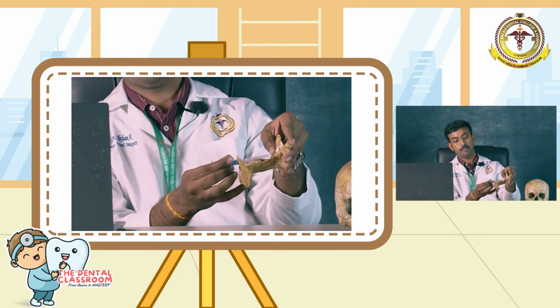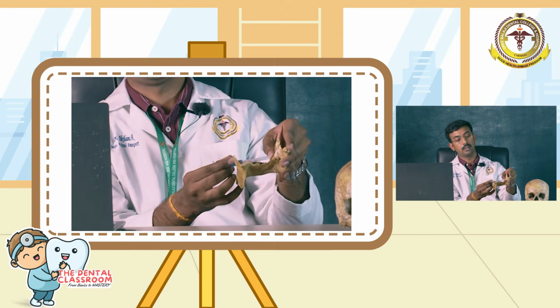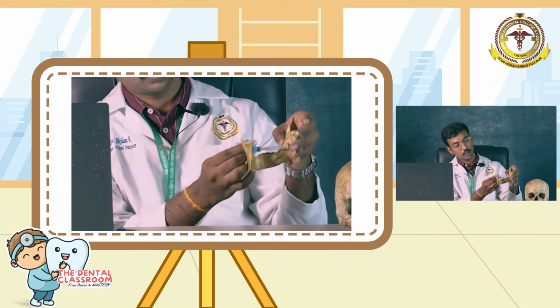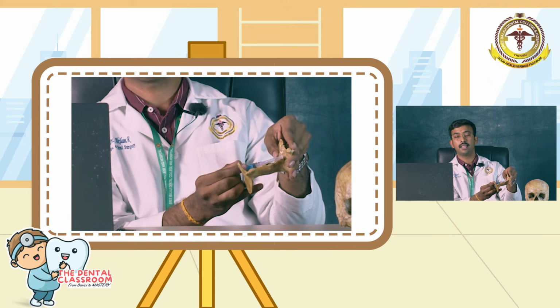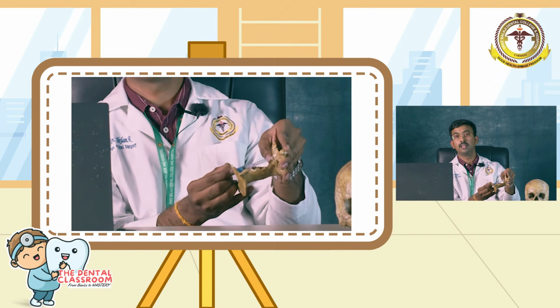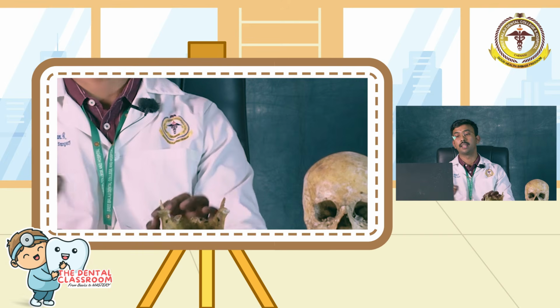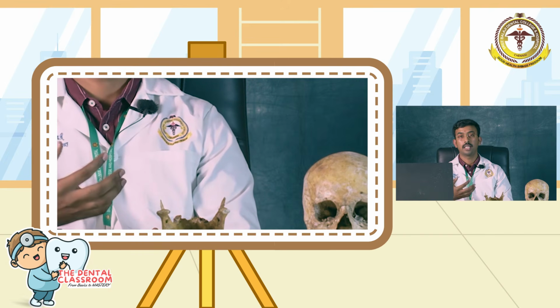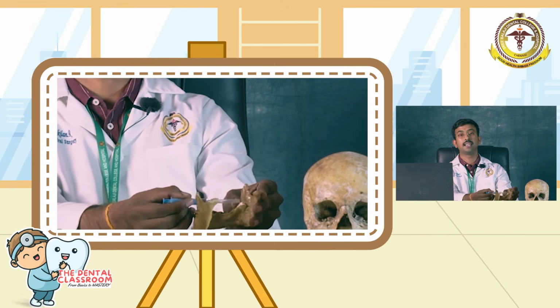So, once I start penetrating the soft tissue, I have to go straight without changing the angulation until I hit the bone. As you can see, as I proceed, the tip of the needle is approaching our target area, which is the inferior alveolar nerve as or before it enters the mandibular foramen. The ideal penetration depth for an adult patient would be 20 to 25 mm, which is 2/3 or 3/4 of a long needle. If the bone is contacted too soon, it means we have approached too far anteriorly.